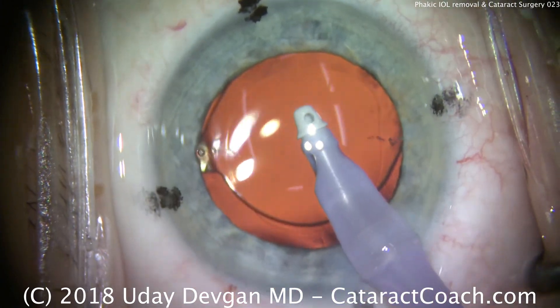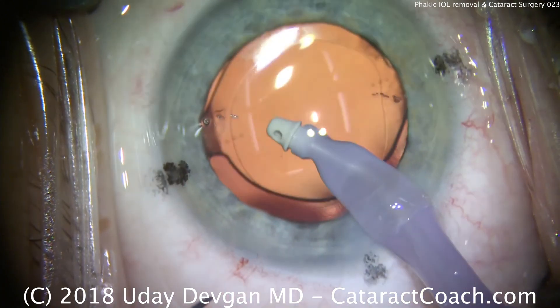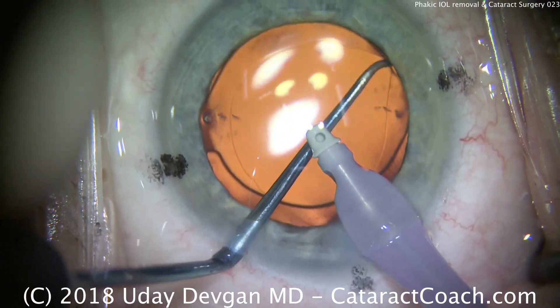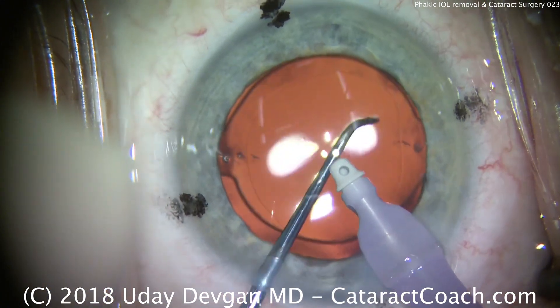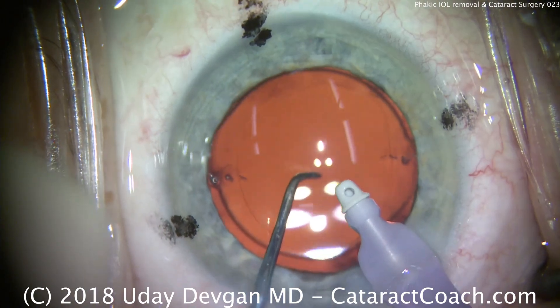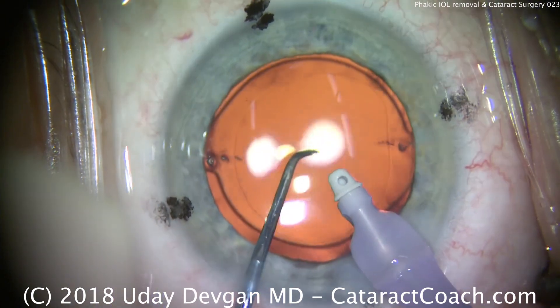So interesting case here. Please read the article for more information on how to plan for these cases, how to do the lens calculations, etc. There — using the chopper just to dial the lens around. Look at the two Purkinje images of the light reflexes, make sure those are lined up as well. That looks pretty darn good.